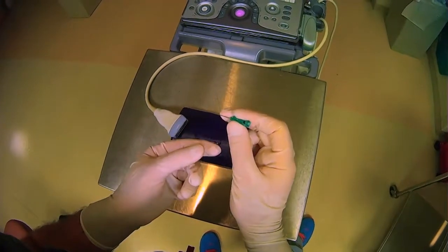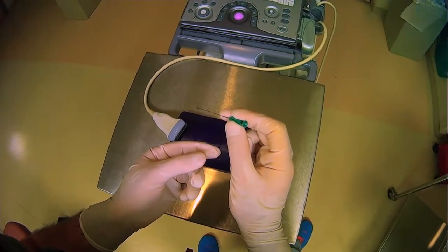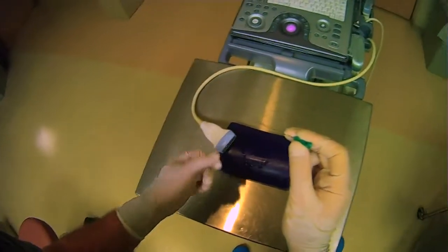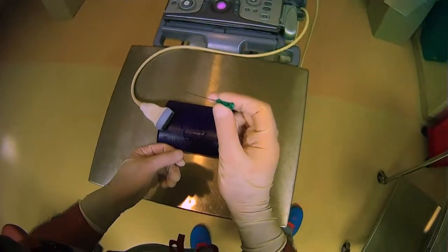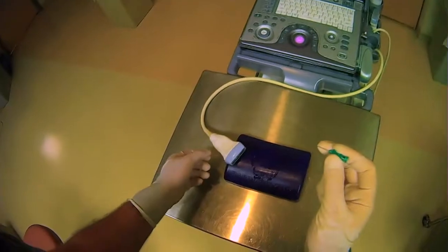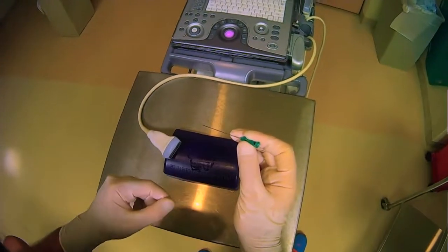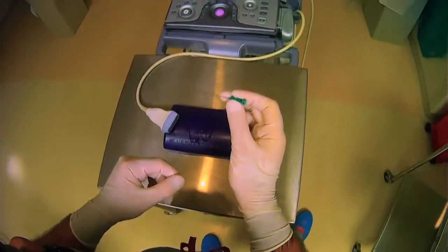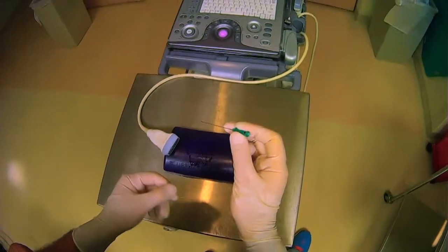So now it's very secure. And just like your ultrasound probe on the other hand, it shouldn't be moving around unnecessarily. Holding your probe properly, holding your equipment properly is going to be very essential to the success of your procedure.